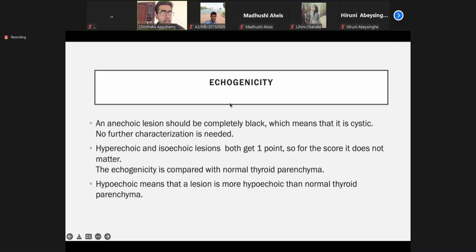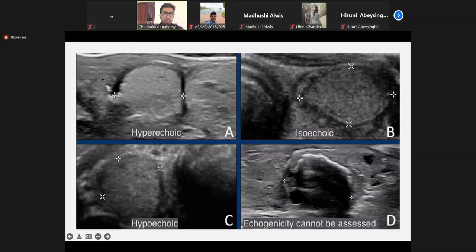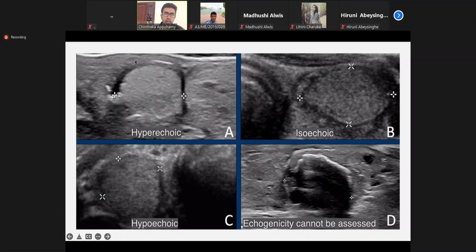Echogenicity is also important. These are nodule examples. These are the surrounding thyroid parenchyma. We always compare with the normal parenchyma. When the nodule is hyperechoic compared to the normal parenchyma — we call that hyperechoic. This one is equal in echogenicity — we call it isoechoic. This one is hypoechoic compared to the surrounding gland.